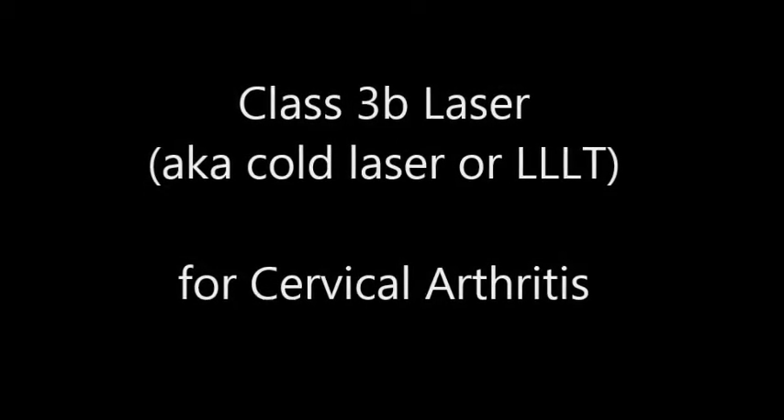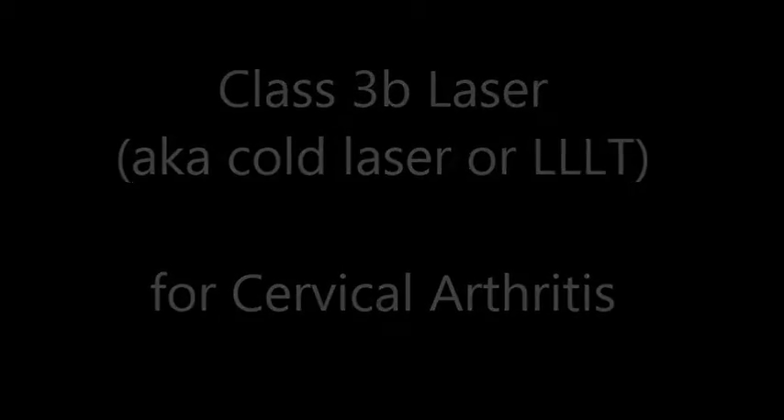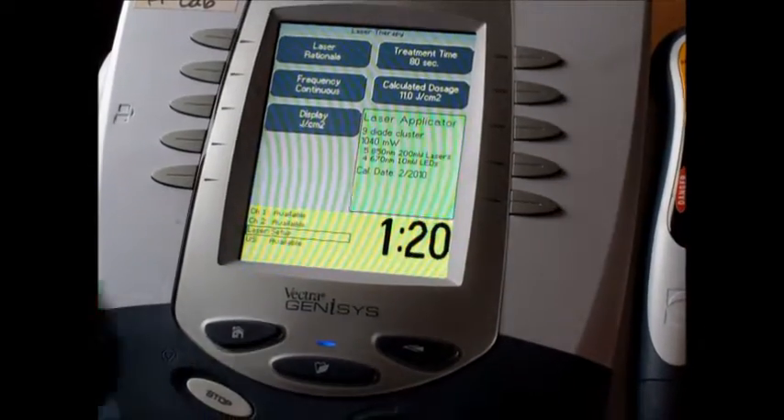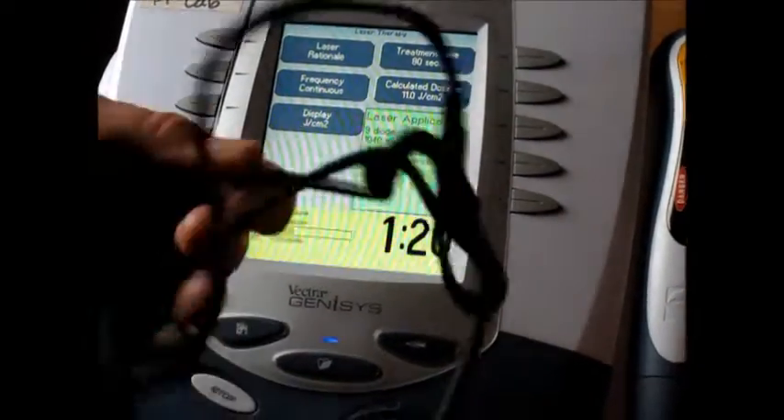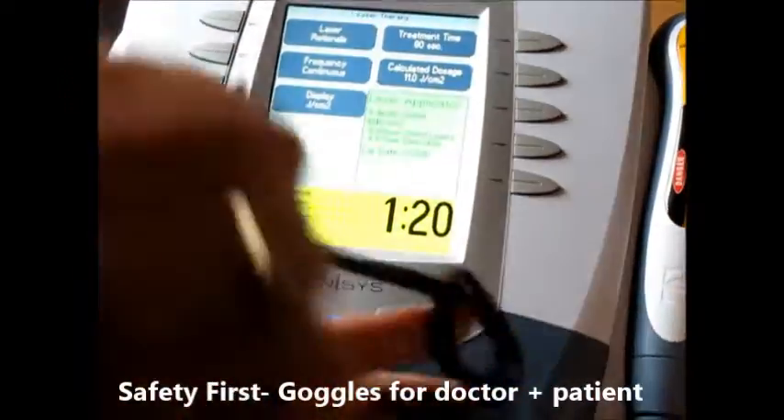Class 3B laser, also known as cold laser or LLLT, for cervical arthritis. Now we're going to do the laser therapy. I've given my patient his pair of glasses and now I'm going to be putting on my pair of glasses.